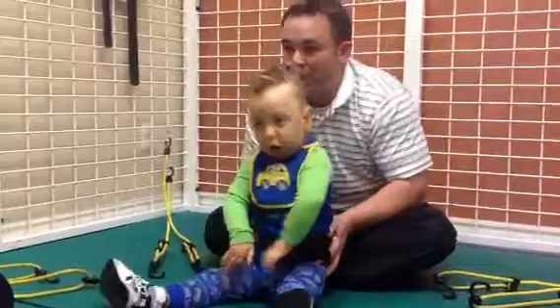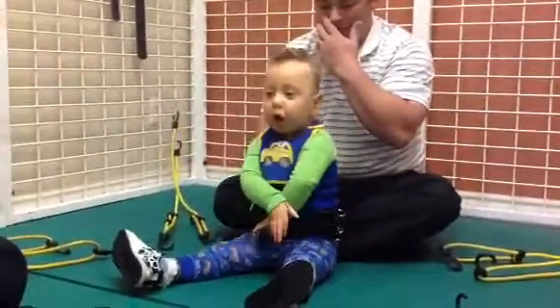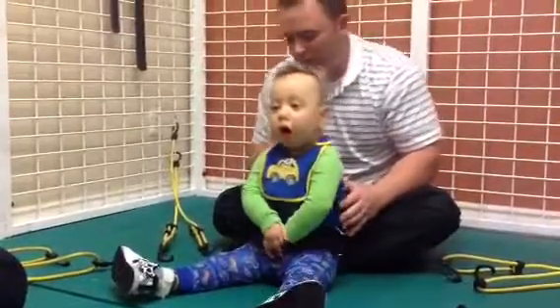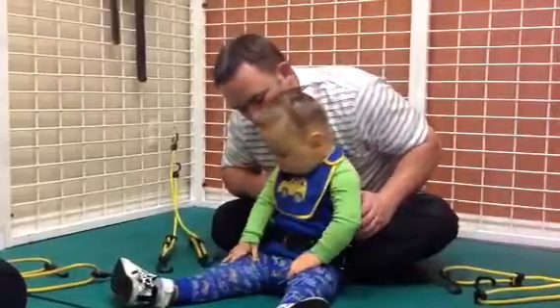Now you just have your belt on. Can you get the belt off? Where does it come off at? Yeah, I know.